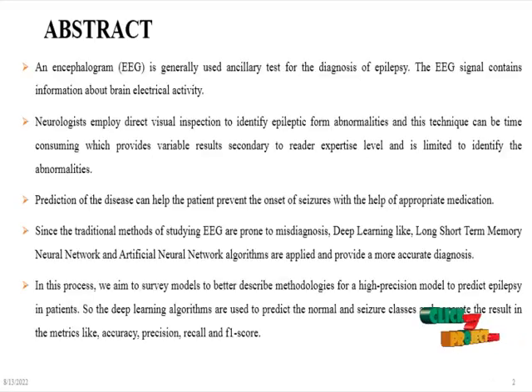The title of the project is Epileptic Seizure Detection by Cascading Isolation, Forest-Based Anomaly Screening and Easy Ensemble. The abstract of the project is: an electroencephalogram is a generally used ancillary test for the diagnosis of epilepsy. The EEG signal contains information about brain electrical activity.